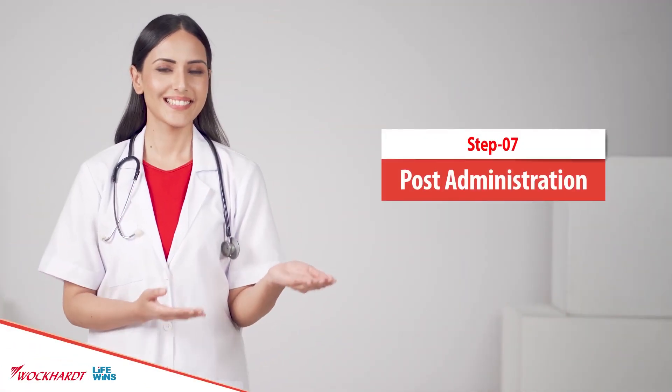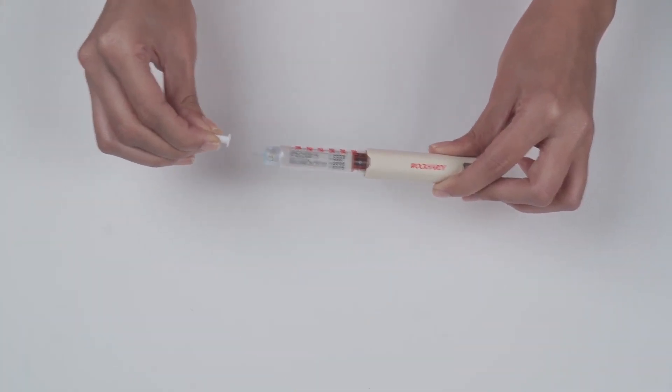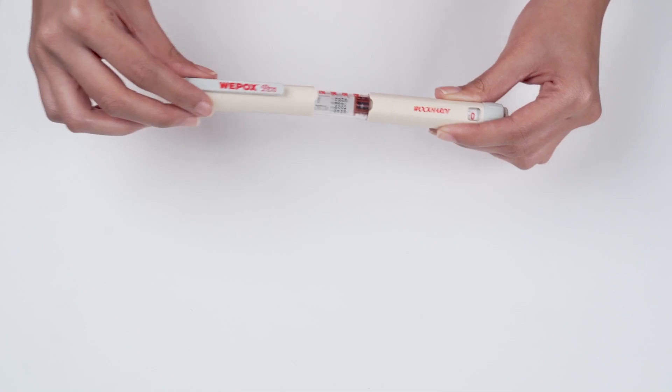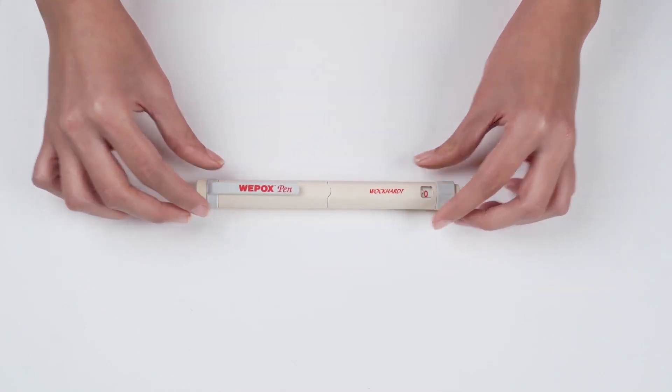Post-administration instructions: reattach the white outer protective needle cap and hold the cartridge holder while removing the needle. It is important to remove and dispose of the needle after every administration. After the dose is administered, cover the pen with the pen cap without removing the cartridge and store it in your refrigerator to maintain its temperature between 2 to 8 degrees Celsius.